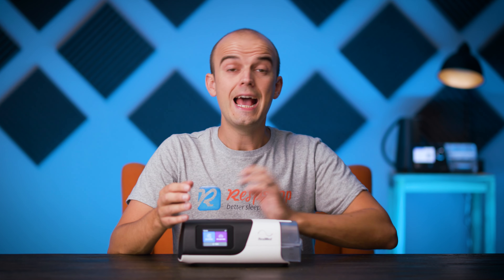The AirSense 11 is the market-leading model of CPAP devices, and it is definitely a high-performing machine. But that doesn't mean that it's for everyone. Here are five reasons why you might reconsider getting it.